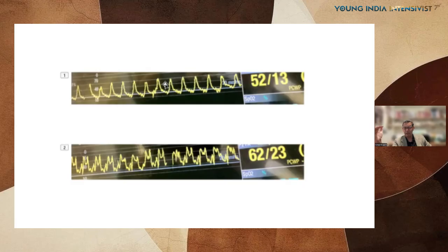And then they get flash pulmonary edema from mitral regurg, and the surgeon's like, well, that can't happen. They're getting decompressed by the impeller. They don't get decompressed. It's complicated. LVADs do a much better job, like a HeartMate 3. But the reason you get pulmonary edema is high mean left atrial pressure, right? So you have to know which part of the venous, the wedge tracing implies what.